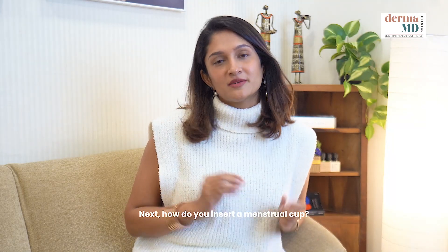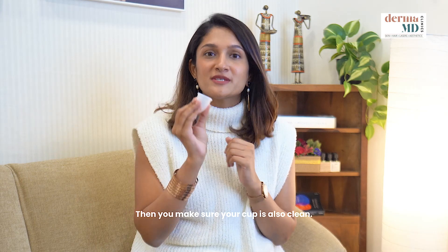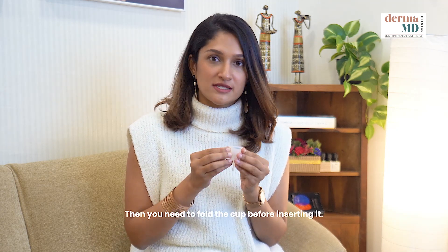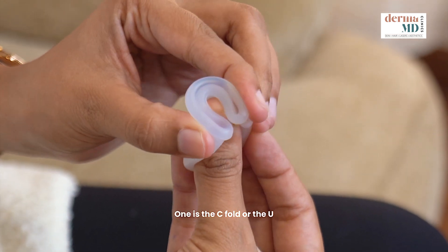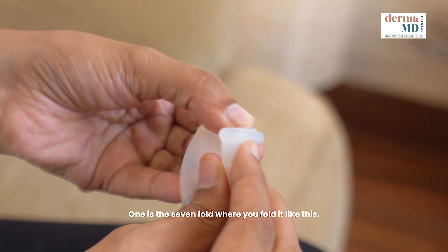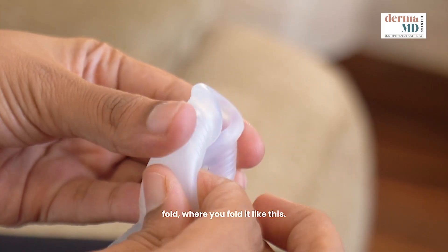Next, how do you insert a menstrual cup? First, wash your hands clean, then make sure your cup is also clean — washed and rinsed well. Then you need to fold the cup before inserting it. There are a couple of techniques: one is the C fold or U fold, one is the seven fold, and lastly there is the punch-down fold.